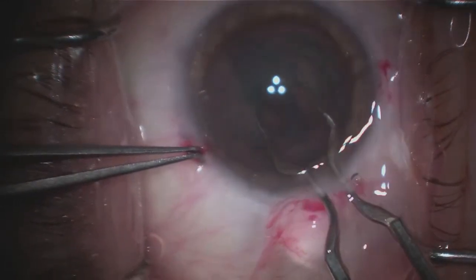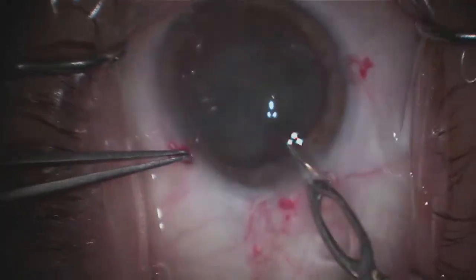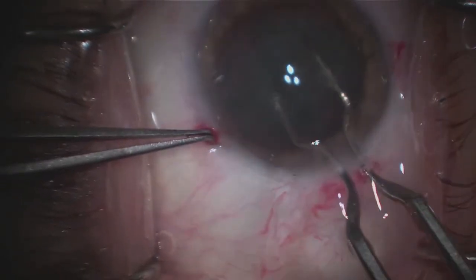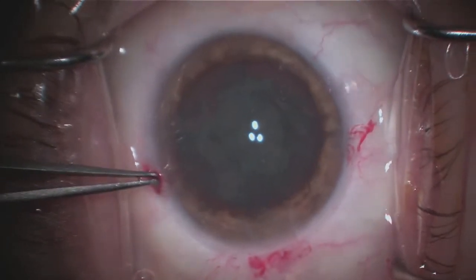With my left hand, I'm actually stabilizing the eye. Next, I'm rotating the cataract just 90 degrees and creating a separation of the cataract, resulting in essentially four parts of the cataract.